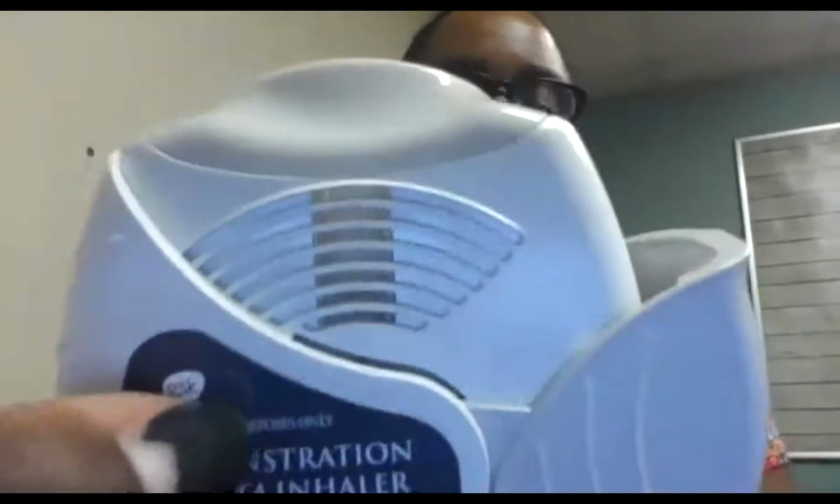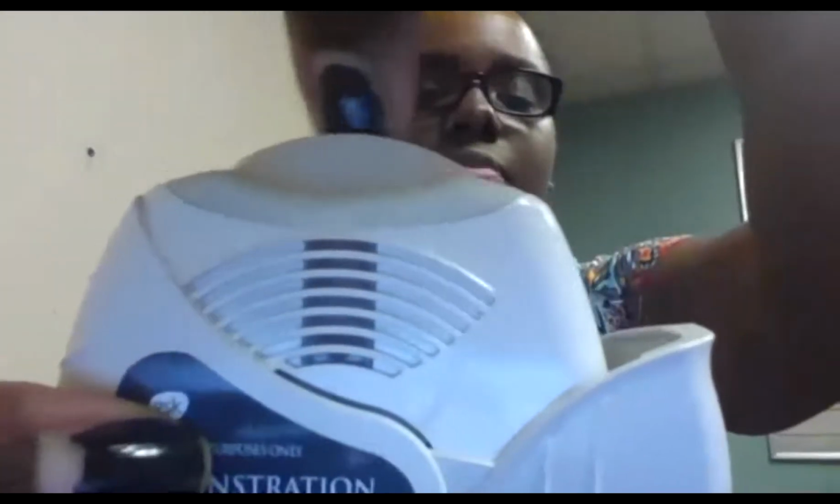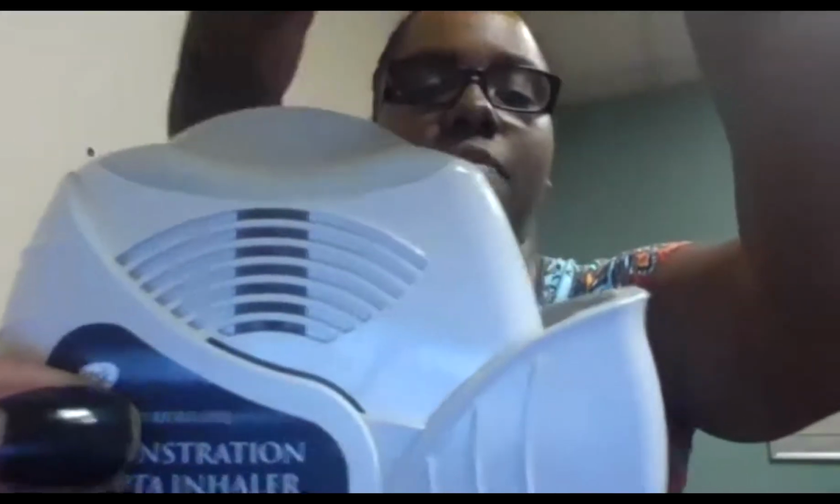You want to hold this like a sandwich too, because it is a powder inside of this medication. You form a tight seal, but what's very important about this particular inhaler is you see these vents here. You do not want to cover these vents with your finger. You don't want to cover them with your mouth, because then you might not get the full dose. It might not work. So make sure that you just form a seal right around this area. It's kind of formed for your lips anyway. So form a seal around here, and then you want to hold it like a sandwich. Don't turn it upside down, and put your mouth around it, and then inhale sharply.